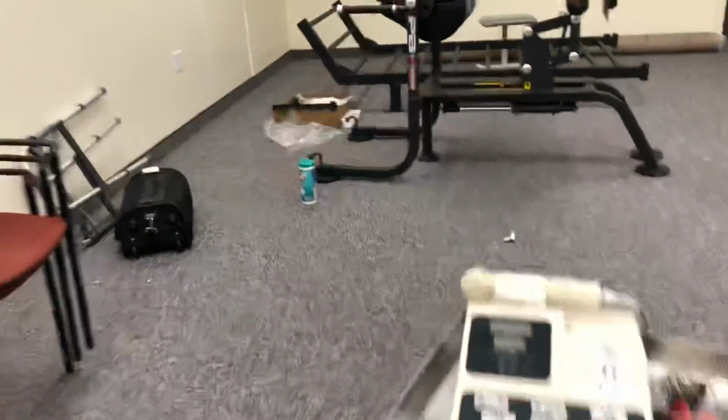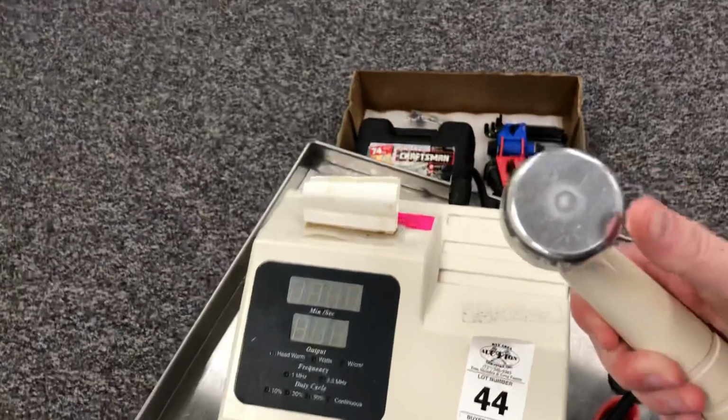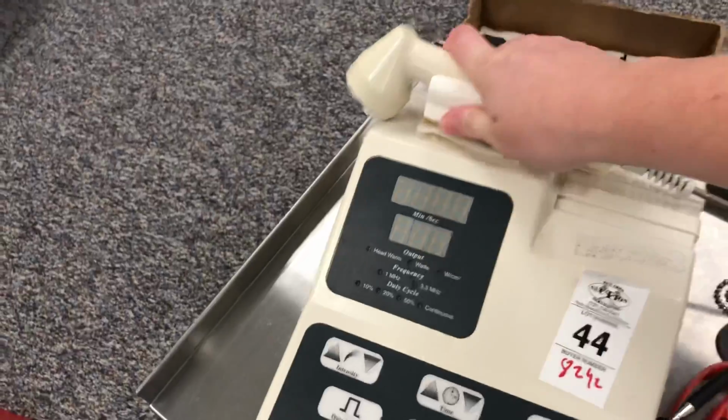Now, for those of you who don't know what the transducer head looks like, so this is the ultrasound machine. It'd be the round head right there. All right, thank you. That's our demonstration on ultrasound.